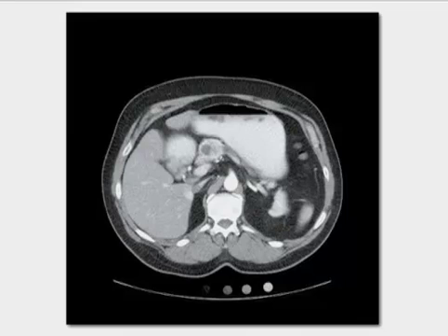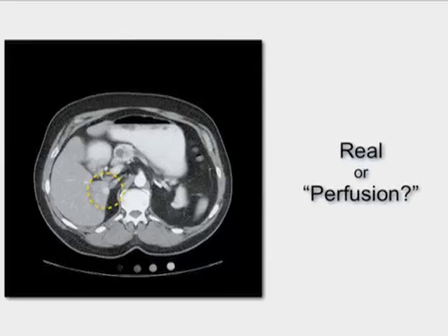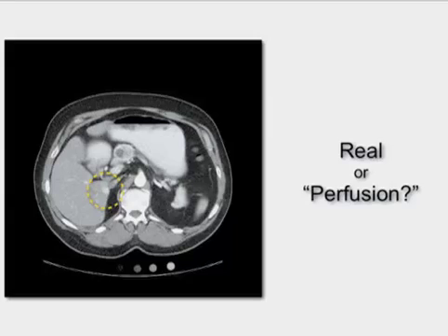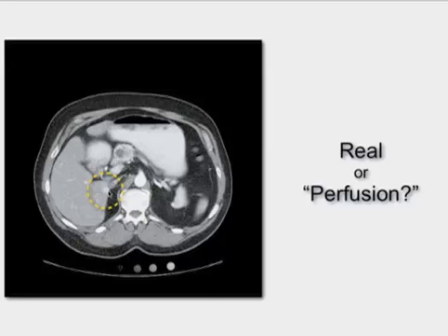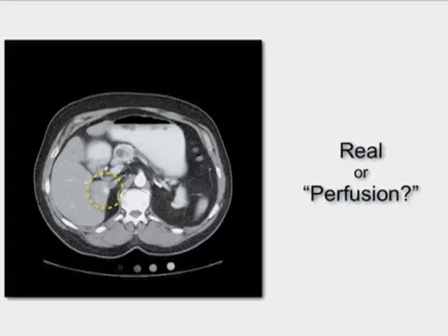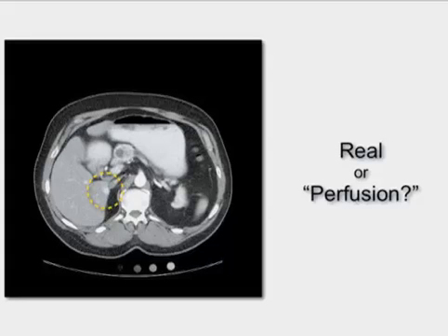Here's another example of an axial image of the upper to mid abdomen. You'll notice there is a small enhancing lesion in the liver that I've outlined. The question often comes up whether this is real or a perfusion abnormality — something we encounter very commonly at UAB evaluating multiphasic CT with arterial phase studies. In this case, there is also an enhancing pancreatic mass in a patient with a neuroendocrine tumor, and this is a hypervascular metastasis. But quite commonly, we see these and follow-up CTs show they're not real. How great it would be if combining contrast ultrasound with multimodality image fusion, we can quickly decide using just ultrasound that something is not real and obviate the need for as much CT follow-up as we do now.